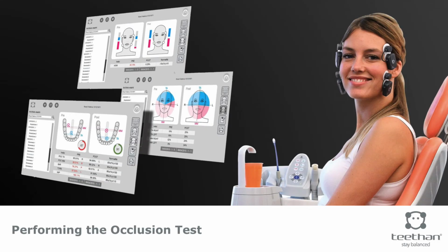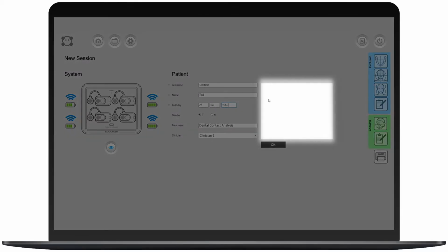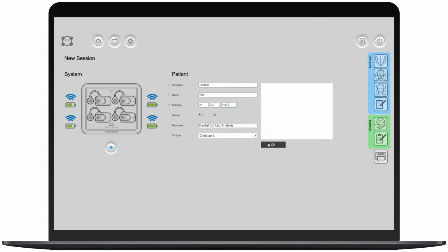Performing the occlusion test. Once a new patient has been added or an existing patient has been recalled from the database, click OK to proceed to the test. Prepare the patient by applying the probes and ensure that the patient is sitting in a relaxed position with their arms resting on their legs, a straight back, and without crossed legs.